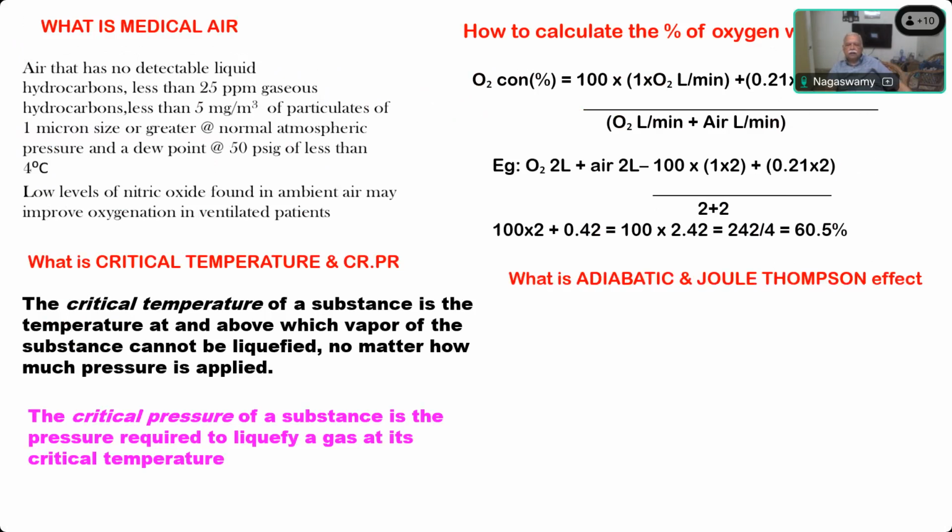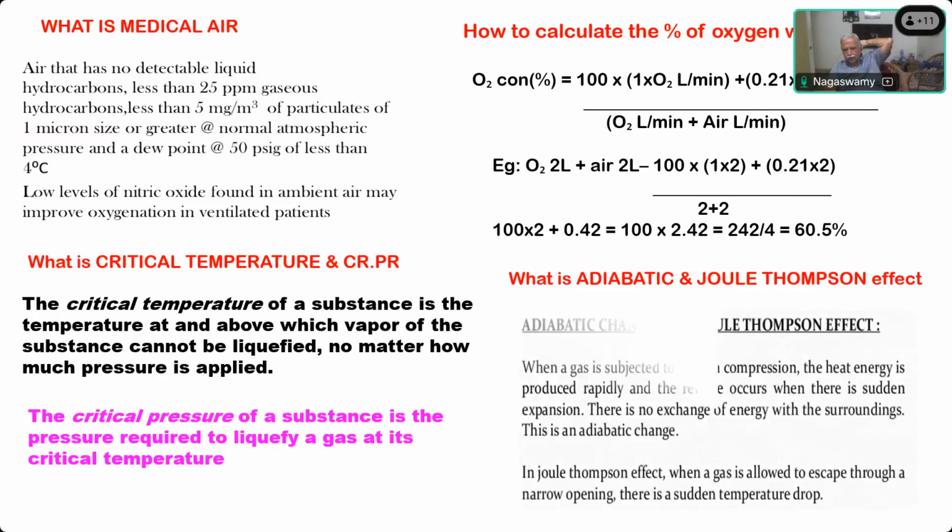And this is another definition, adiabatic and Joule-Thomson effect. Can anyone define this? What is adiabatic effect and Joule-Thomson effect? Cooling of the temperature while a gas is released from the cylinder. Very good. Is that adiabatic or Joule-Thomson? Joule-Thomson. What about adiabatic? No heat is released.